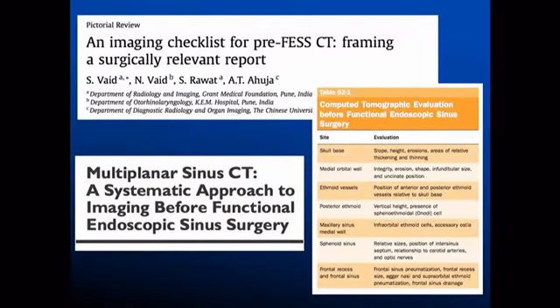There's lots of different articles showing frameworks, checklists, various different approaches to sinus reporting, and some of them are quite complex and can go into a lot of detail. And again, you really shouldn't be reporting in this much detail unless the patient's coming to an ENT surgeon and is actually going to be having endoscopic sinus surgery.